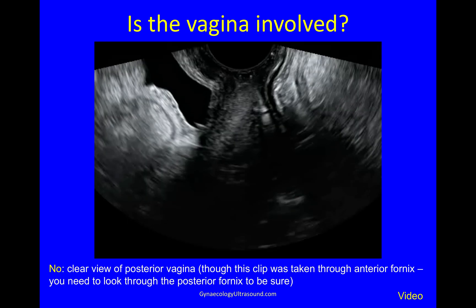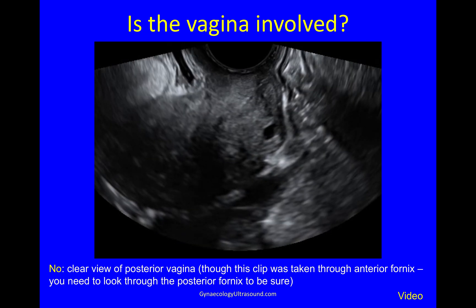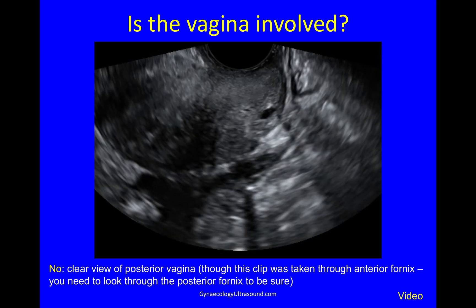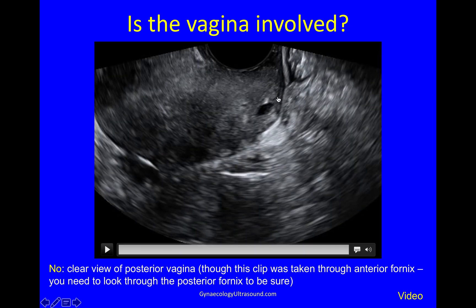We still haven't looked at whether the vagina is involved. Here I am looking specifically at vaginal involvement — I'm inserting the probe very gently. Even though I've stayed in the anterior fornix, I can see that where the vagina attaches to the back of the cervix, all of this is normal. There's no vaginal nodule, but I will have put the probe in the posterior fornix to double-check that because the views are much better.